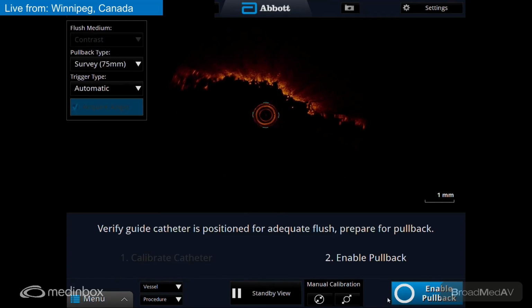And this is already straightened out with our stiff armored sheath. With a stiff armored sheath, it made our guide engagement and delivery a lot easier. Yeah, let's try that and see. We're going to try to go into the stent, go up with the balloon, try to drive our guideliner through.